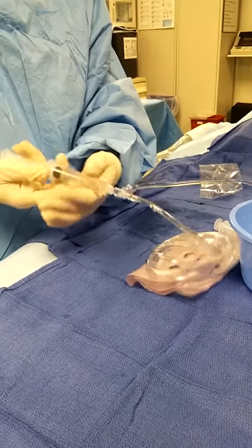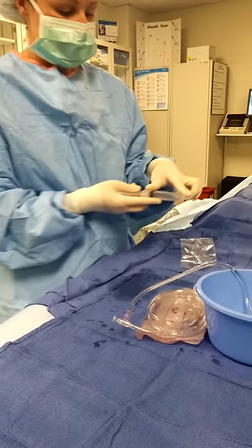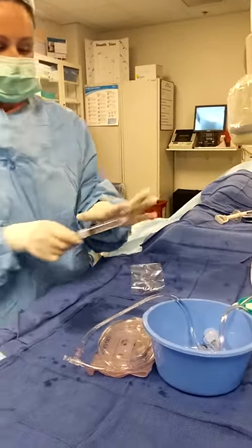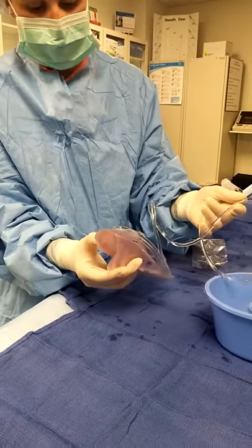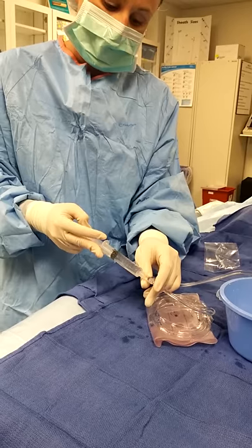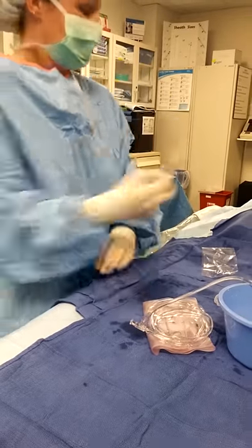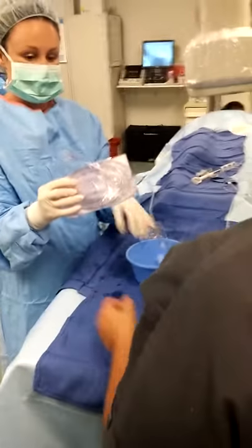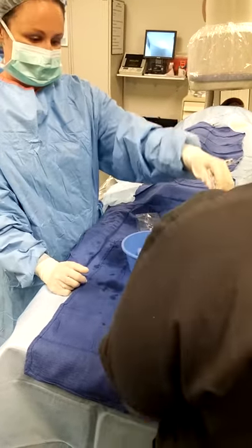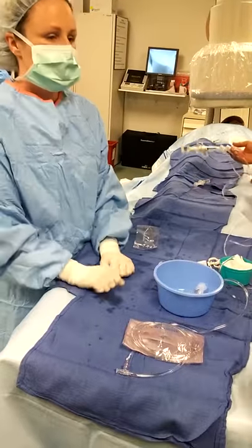I can draw back a fresh syringe full of flush. Let's say this was filled with yucky heme — doc handed it to me, he flushed the sheath, it's bright red. I'd hook it up here, squirt the heme into my waste bag, then draw back heparinized saline, and push a little bit forward when you're taking it off because you're going to get heme stuck in that. The waste bag is great — you can push blood in there but draw clear, clean flush through it. It doesn't let you draw back — the two will never meet. This just sits on your back table; I do not open it up.